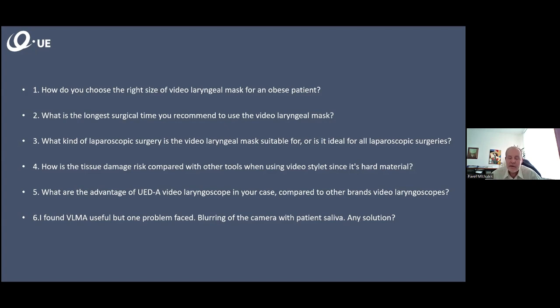airway. And the last thing is that your advancement should be very careful, and always when you see nothing, meaning when you see only pink tissue or saliva, you should either suck it out or return slightly back, because you should always be able to see some structures, such as in flexible endoscopy.